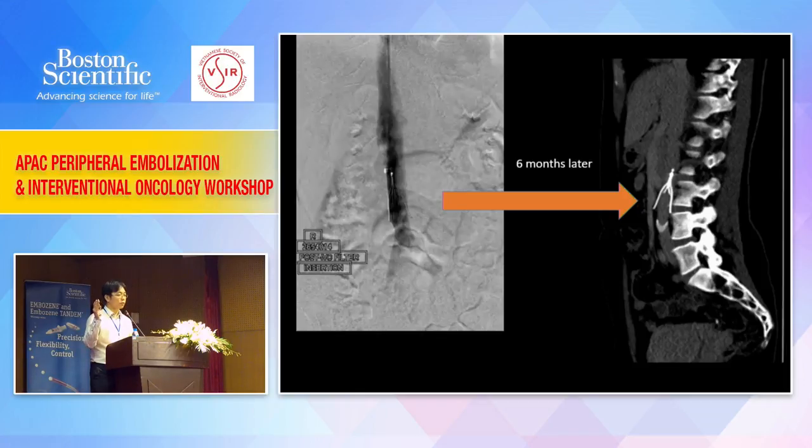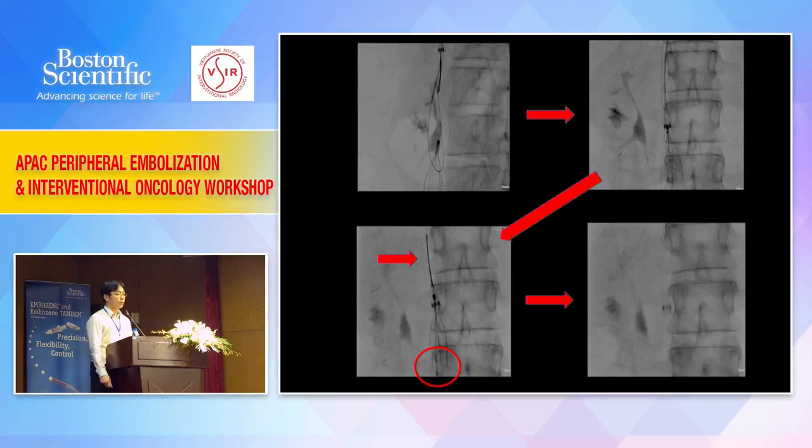And this patient was very, very naughty. She's a young lady. She travels overseas all the time. We called her a few times. Can you please come back to have the filter removed? Okay, then she didn't turn up. And then 6 months later, just to see where the tip of the IVC filter is, you can see very clearly that the tip of the IVC filter is sticking out, or at least very close to and endothelialized into the IVC.